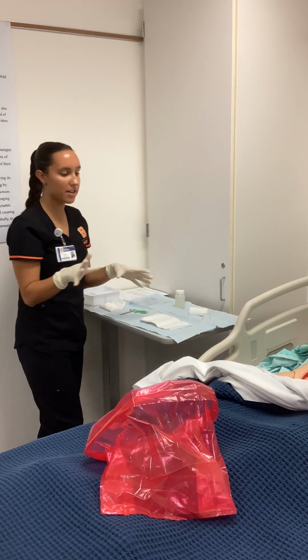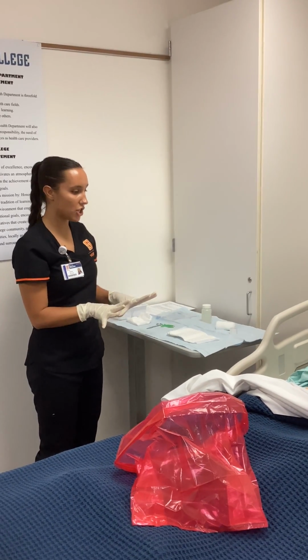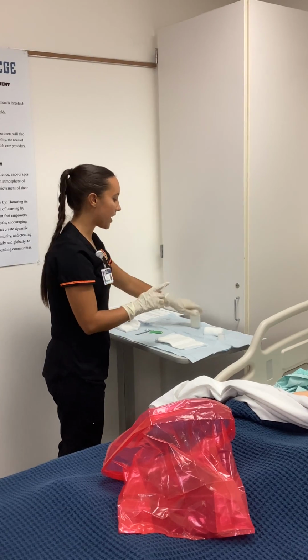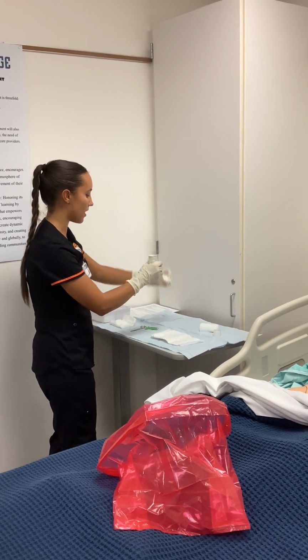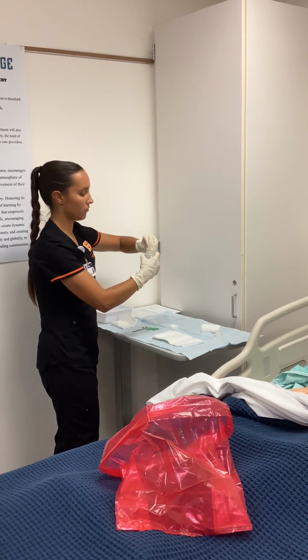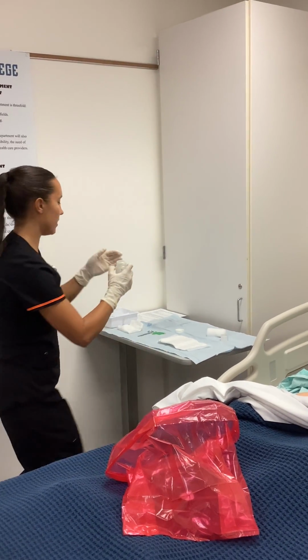Okay, there's so many different ways that you can clean a wound, and it really just depends on the patient. So you could irrigate it, you could dump the saline on the gauze, but for now, we are gonna be dumping it into our container. So I'm just gonna open this up. I'm gonna throw this away, and I'm gonna dump this in here.